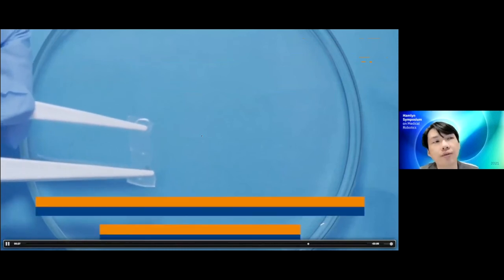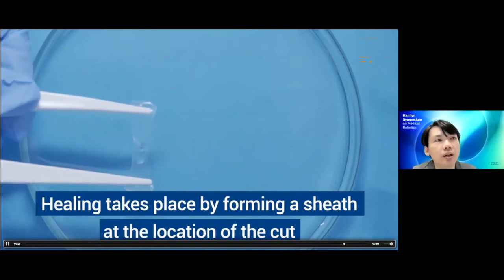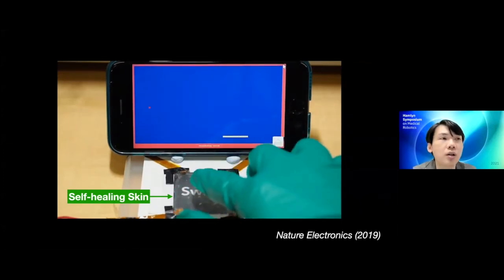So we can have such materials because they're conductive and transparent. There are uses such as human-machine interfaces, playing games and so on. But one can imagine having such materials for controlling surgical robots, or actually putting such materials within the body, because the material that we use is what sutures are made of. But we will have to replace the ions that we use to make it more biocompatible.